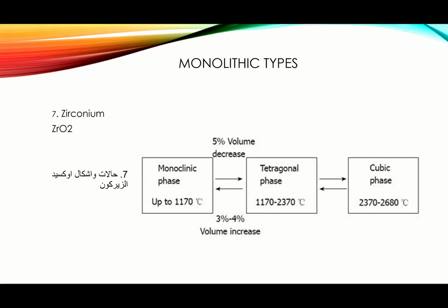Now those are the 3 phases of zirconia. We have monoclinic phase, we have tetragonal phase, and we have cubic phase. Now let's establish something here, that all we're talking about is zirconium oxide. It's the same composition. It's a zirconium oxide, all right? These are phases, the way the molecule looks, the way it's formed. This form of the zirconium molecules gives you different physical properties. Some of them are very desirable, like tetragonal and cubic. Some of them are less desirable, like the monoclinic.